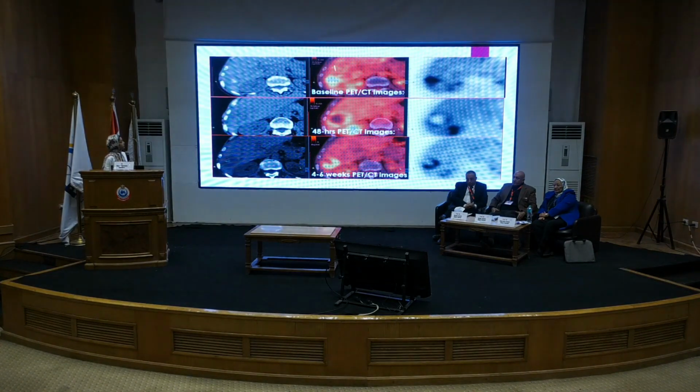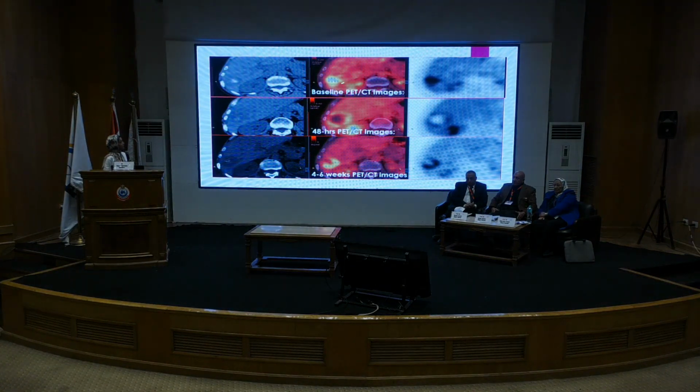Case number 5. This patient had segment 6 active hepatic focal lesions. She underwent RFA, but not at 24 hours. She did the PET-CT images at 48 hours, and we observed a rim of activity all over the ablation zone, with focal nodular uptake also.